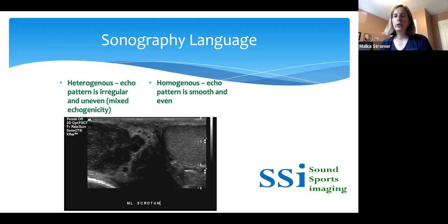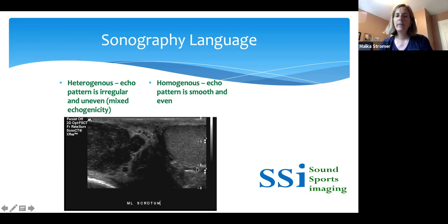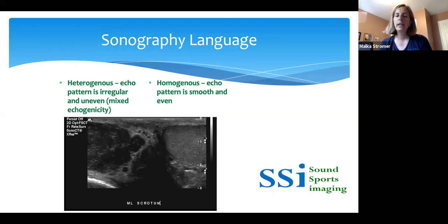It's also important to understand the terms heterogeneous and homogeneous when we look at soft tissue masses. Something that is homogeneous has a smooth echo texture throughout. Something that is heterogeneous may have different echoes within the mass and maybe irregular borders. We're looking at a scrotal sac — one with the left testicle quite normal, and the right testicle quite abnormal: heterogeneous echo texture and invasion into the scrotal wall, which would be a testicular cancer.